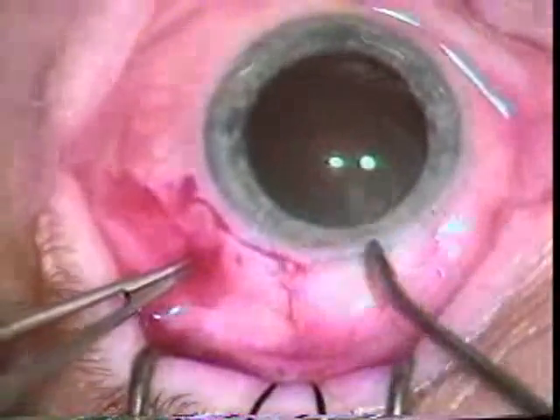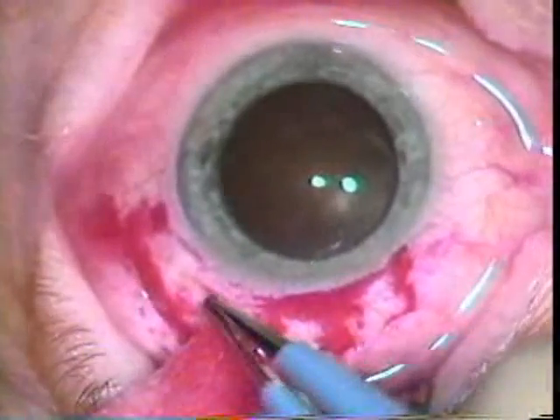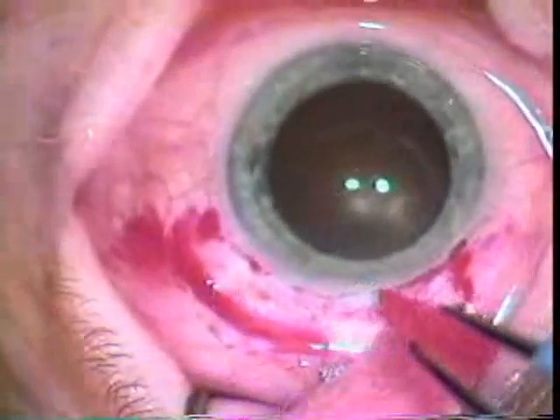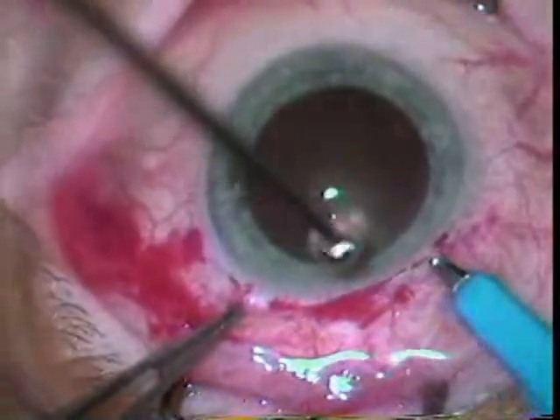Now he's using the gill knife to clean up some residual episcleral and conjunctival tissue. Bipolar electrocautery is used to achieve hemostasis. Remember that it's important to have a spark gap for that to work.